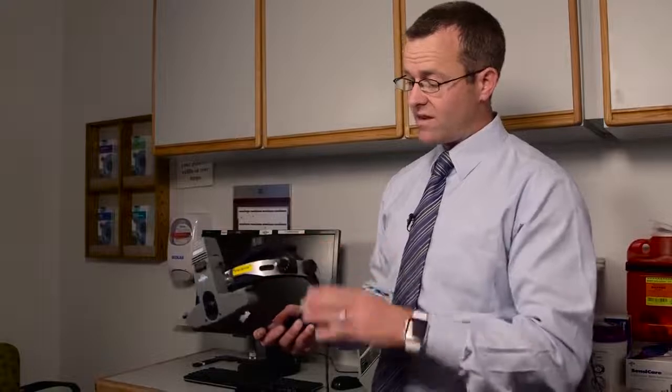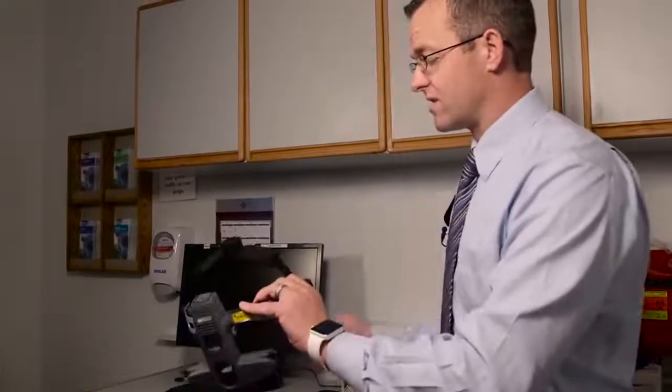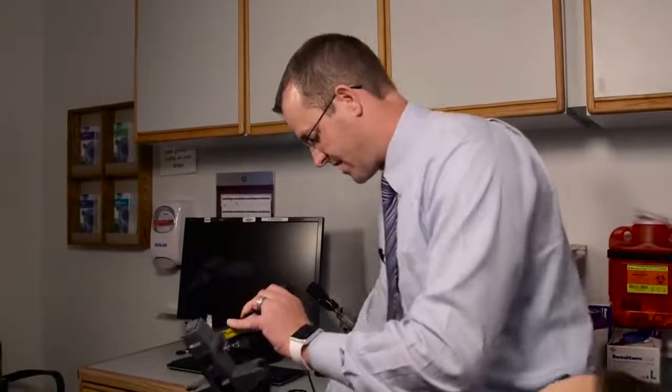And so first of all, a key concept in learning this is to take the time to learn it and to get comfortable by making sure that the beams, the head positioning, the width of your two eyepieces are in the right location so that you're comfortable. You're going to better be able to assess and view the patient's posterior segment and out into the periphery of their eye.